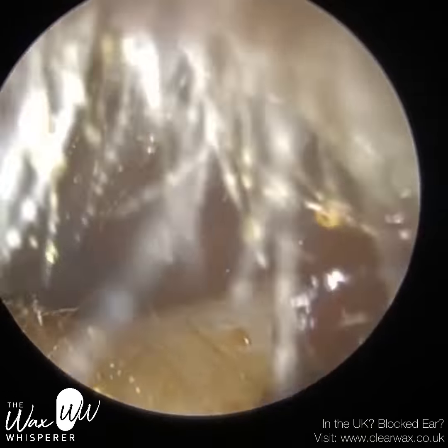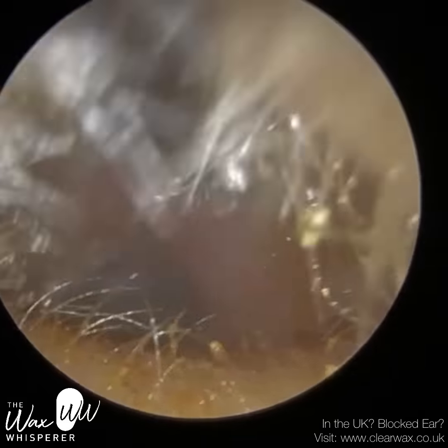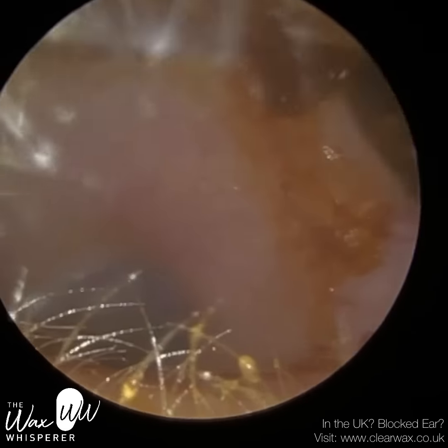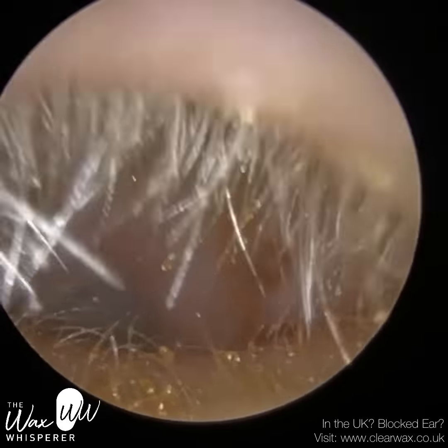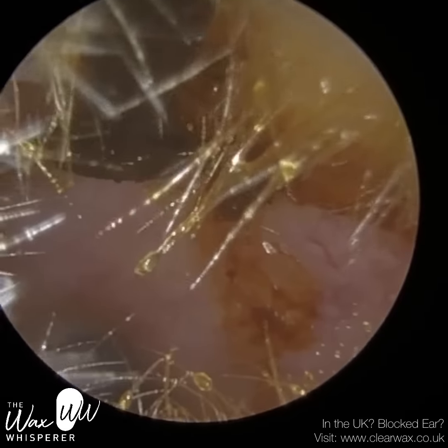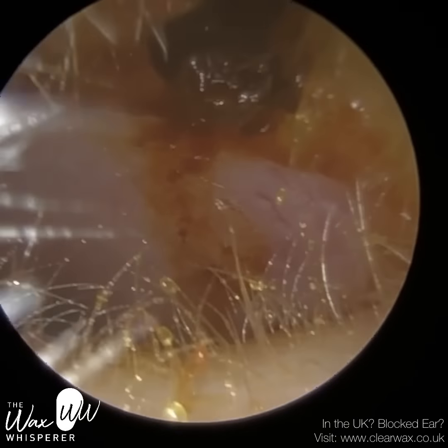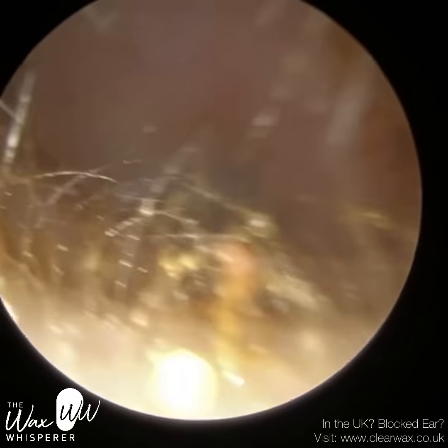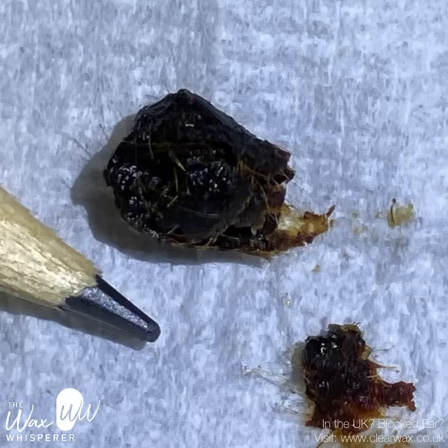The endoscope's lined up to look directly into the ear canal, but the ear canal veers off to the left and we can only see the back part of the eardrum here. This wax is almost in a blind spot — with most instrumentation, you wouldn't see this. In most people's ears, near the back entrance — in the case of the right ear it's to the left near the entrance, and in the case of the left ear where we are now, it's to the right-hand side near the entrance. It's almost like a little blind spot. With an endoscope you're able to visualise it. And sometimes that can be a bit of a negative — you can see everything. Sometimes you don't need to remove all the wax, and that's key. Sometimes seeing less is better, because you're not worried about leaving some insignificant wax behind.